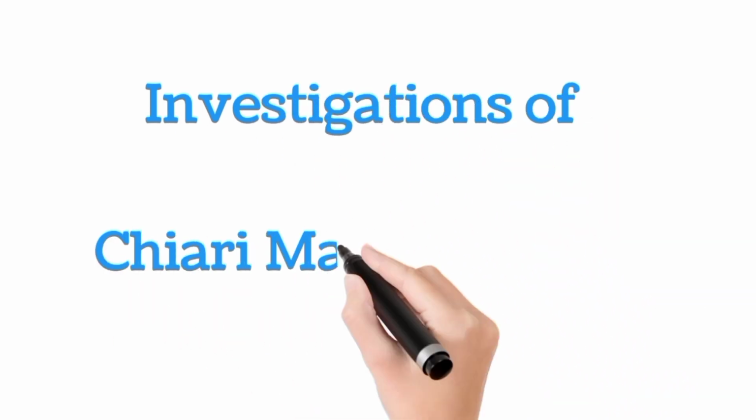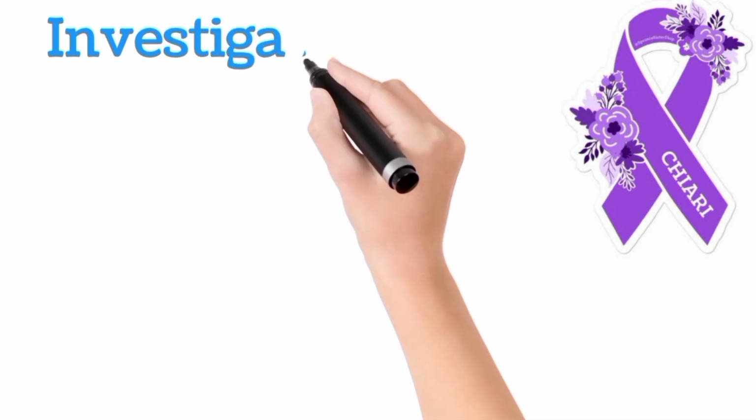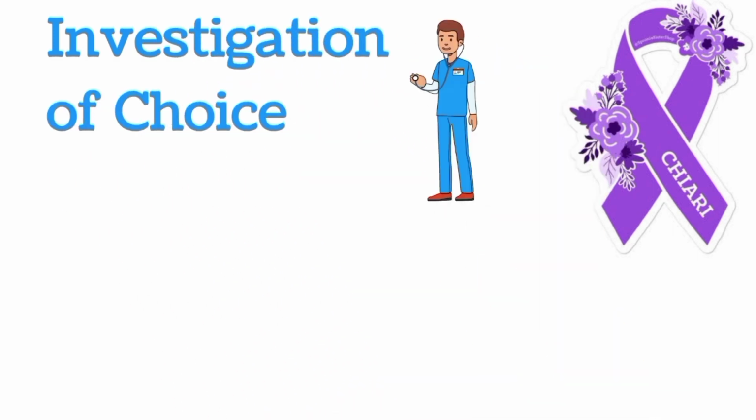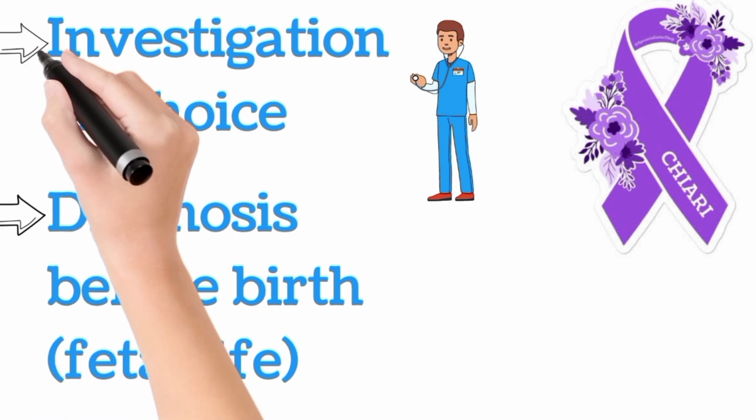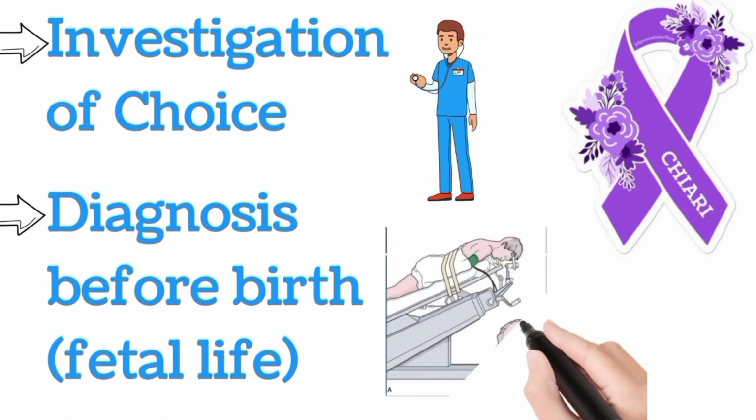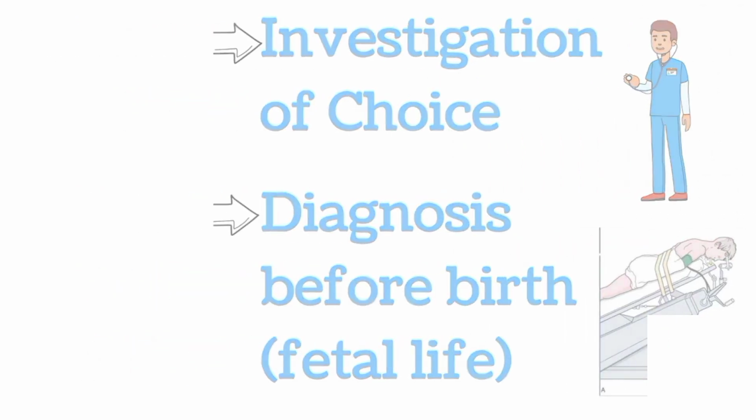Today we are going to talk about investigations of Chiari malformation. In this video we will see which investigation is best for the diagnosis and how we can diagnose Chiari malformation in the fetal life. We will also discuss the investigations performed to prepare a patient for surgery.